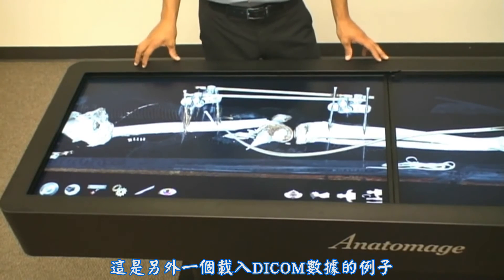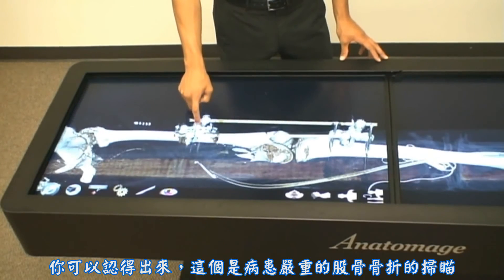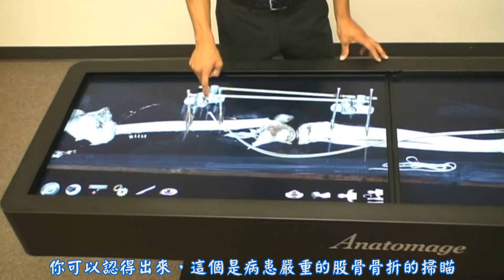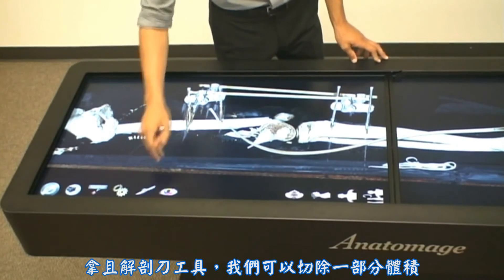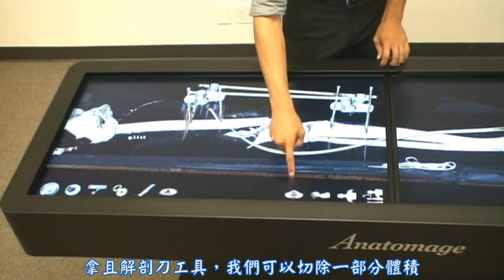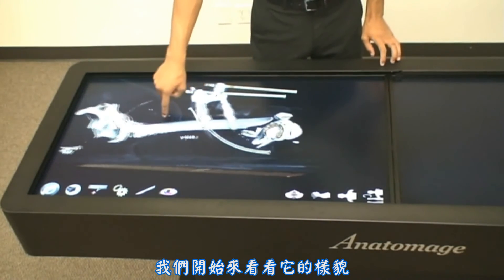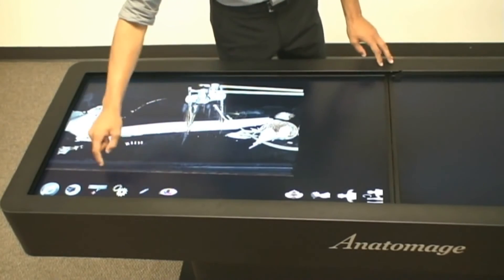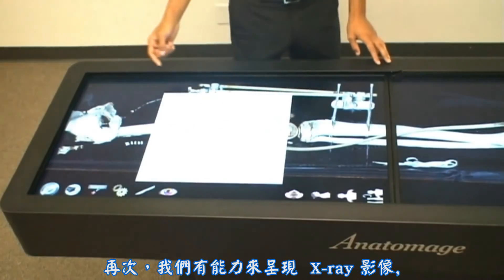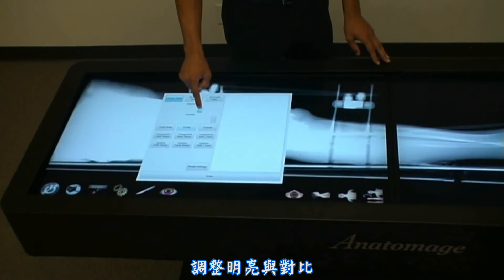Here's another example of loading in your own DICOM dataset. This patient that was scanned has a pretty bad femoral fracture and their leg is being held together with a surgical brace. Clicking on our scalpel tool, we can cut away some of the volume and start to look at it in a different perspective. We also have the ability to create our own X-rays by adjusting the brightness and contrast.